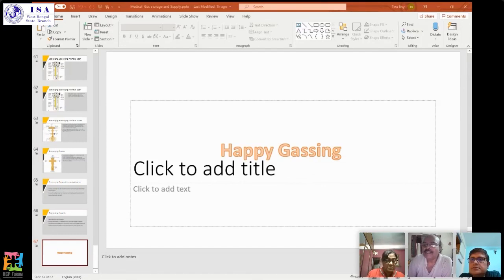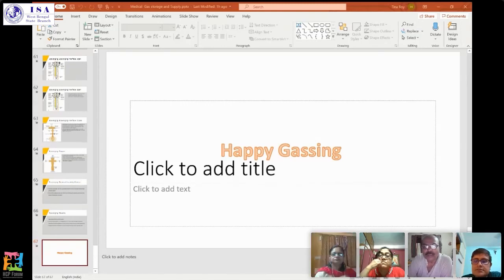One comment comes from Bijan Gupta, the fantastic caller, who has no question. And Dr. Chumki Dutta has given a statement: Mapleson A is not a Lack coaxial system. Now I want Purba to comment on that. Sorry, sir, please repeat the question. Mapleson A is not a Lack coaxial system. That is the comment which has come from Dr. Chumki Dutta.